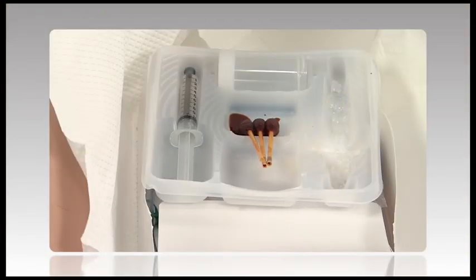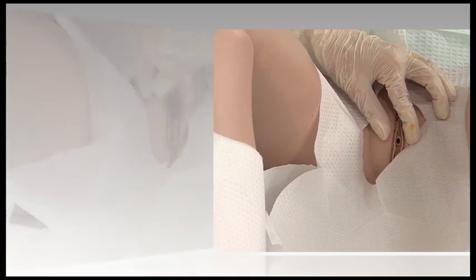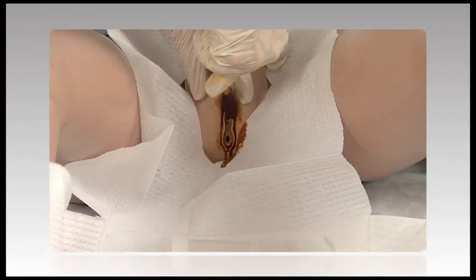Using the pre-saturated antiseptic swab sticks, prepare the patient. With your non-dominant hand, carefully retract the labia to fully expose the urethral meatus. This hand is now contaminated and committed to non-sterile activity. Each swab stick will be used for one swipe only.